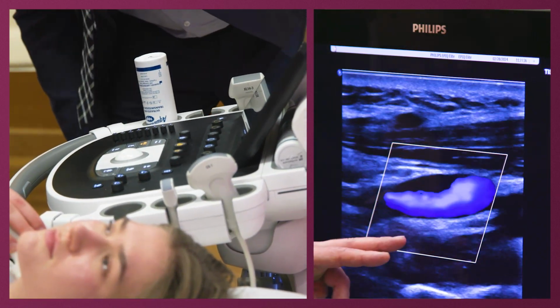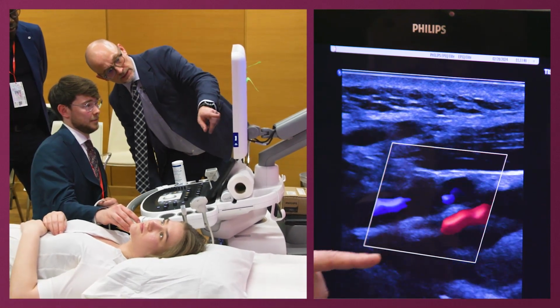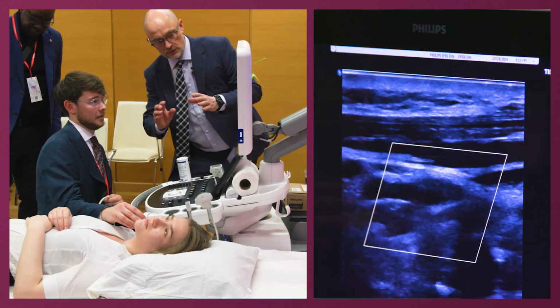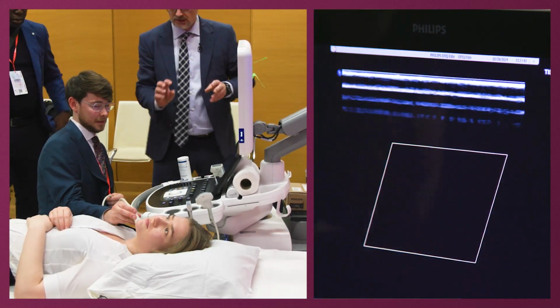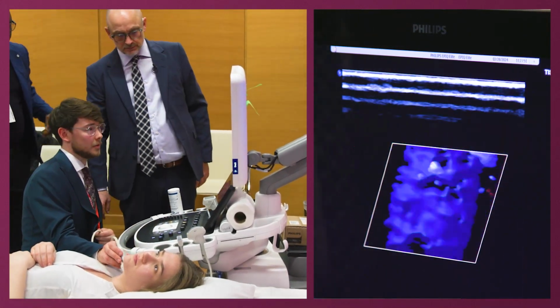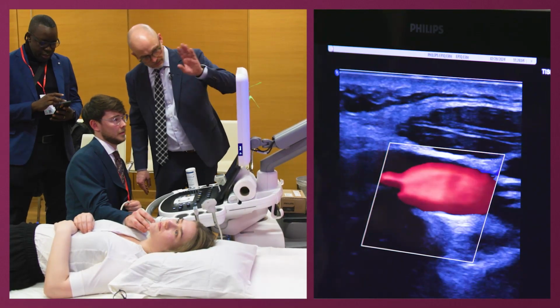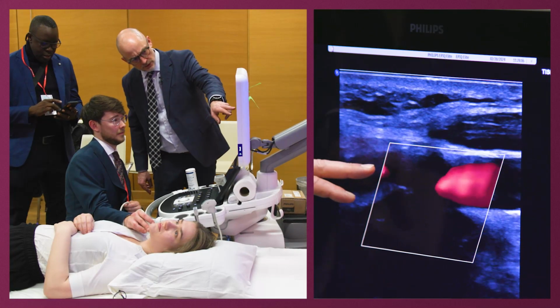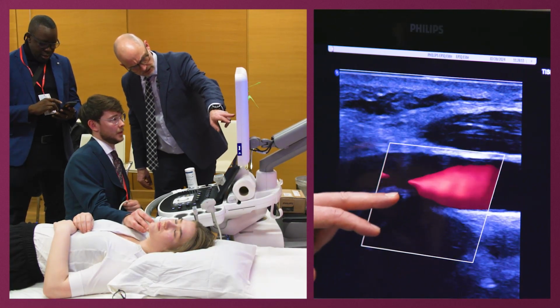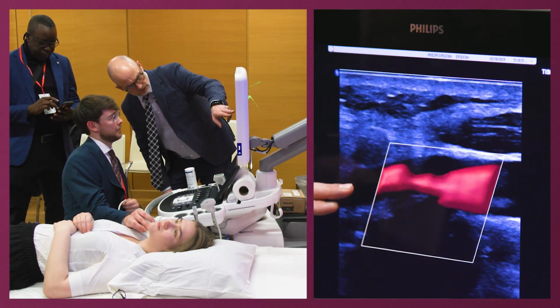So we have the experience that you should try to make very slow movements with your hand. You have one artery here. No, you make two. It should only be in your fingers. That's why you should rest your wrist at the shoulder. Yeah, I forgot to rest. Small movements. Otherwise, we will get dizzy here behind. You have one here. And you have the impression that you have another one here. Yeah. This is a bifurcation. This is a flow split. Very good.